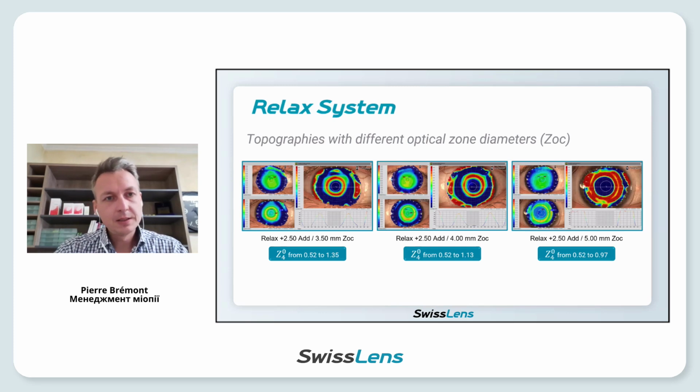Here you can see different results with different options of Relax central optical zone. From left to right, from the smaller central optical zone, 3.5, to the larger, 5 millimeters. And under, you have the result in spherical aberration.